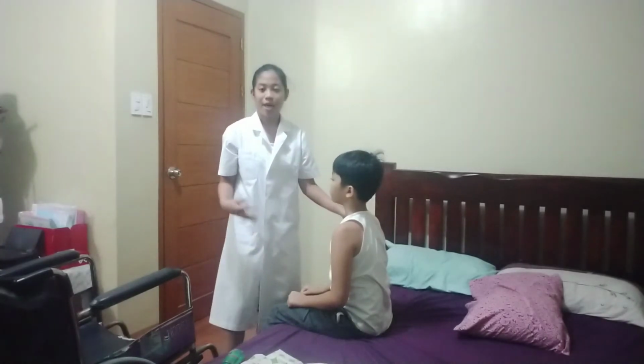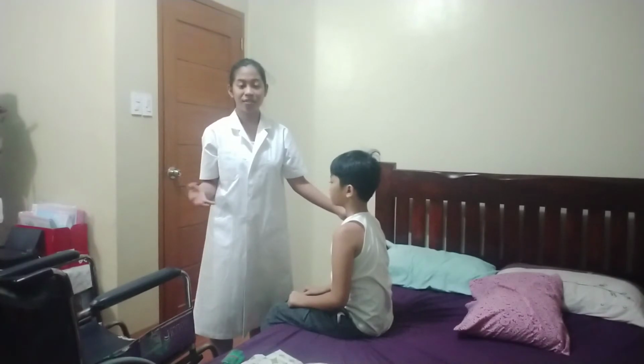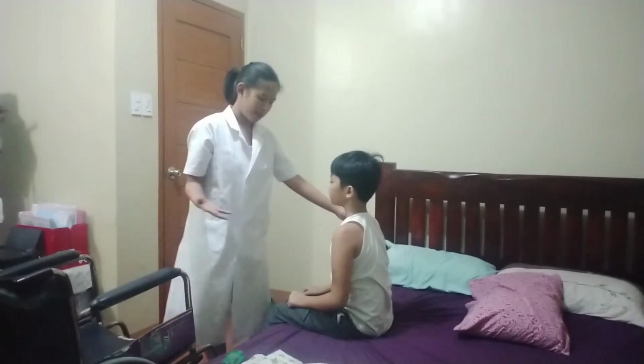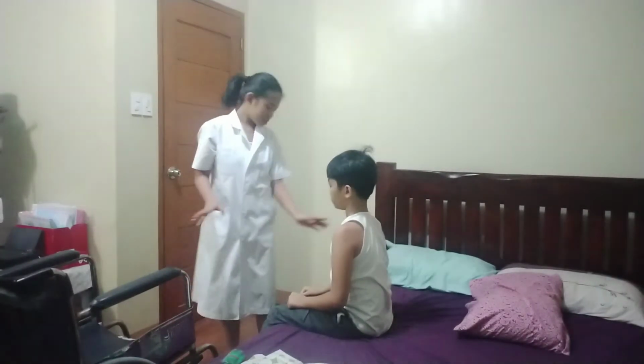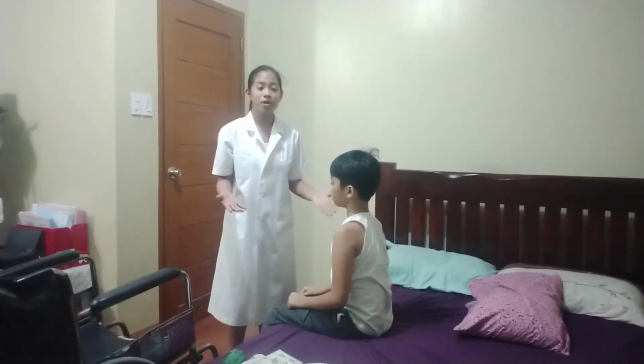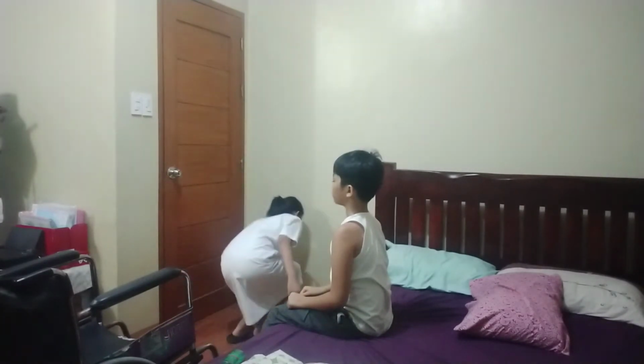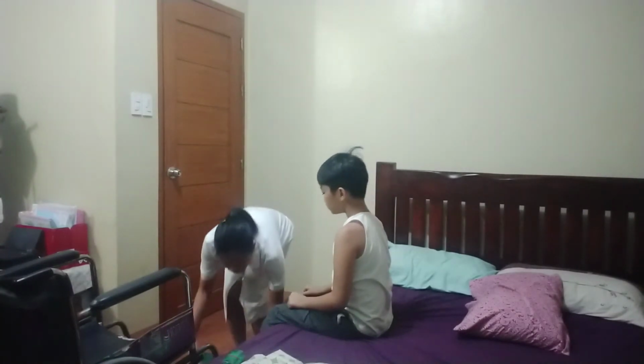Thank you, sir. And then I will allow my patient to dangle his legs for a few minutes before the break. And then I will assist my patient to put on a robe if necessary or available and the non-skid footwear. Please, sir, suot mo muna po ito.